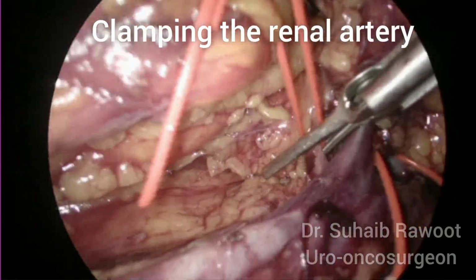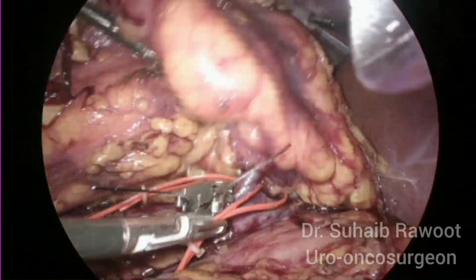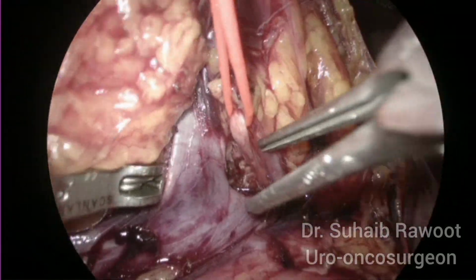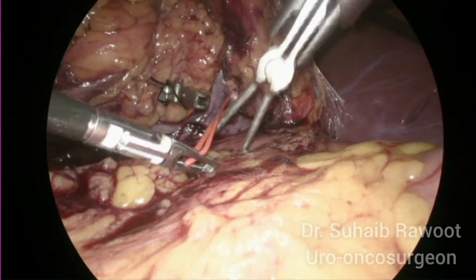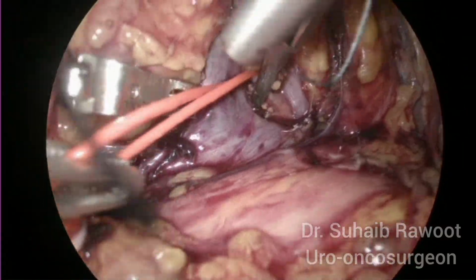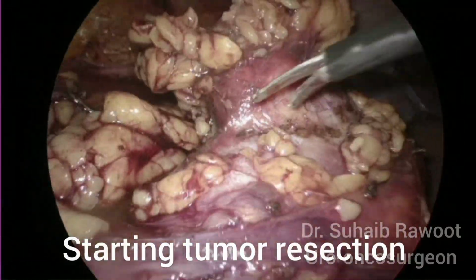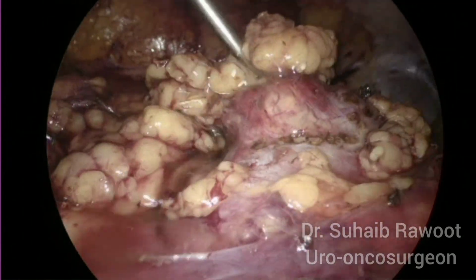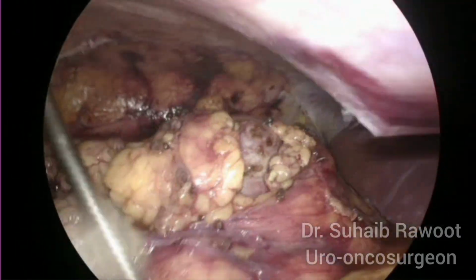We are clamping both the renal arteries. Now we are starting tumor resection. First we cut along the scored margins using cold scissors and then develop a plane as we go inside.